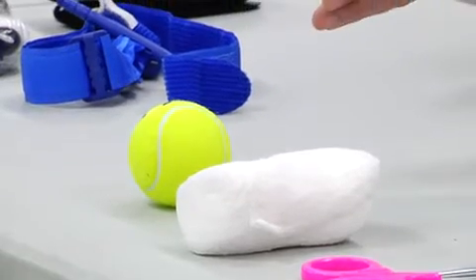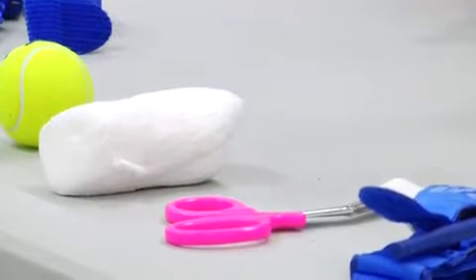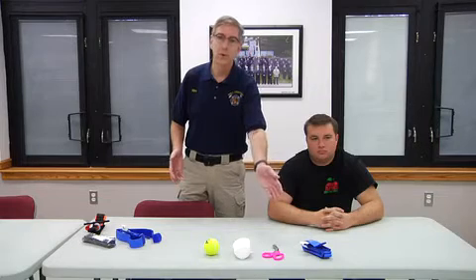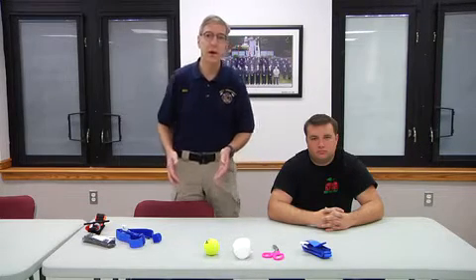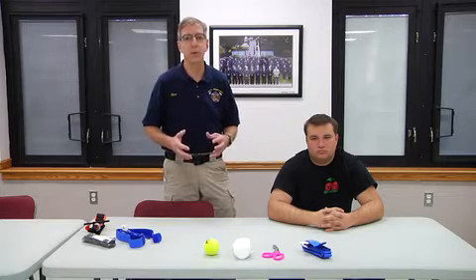We need a tennis ball, roller gauze, preferably 4-inch roller gauze, a pair of scissors to trim the gauze, and a training tourniquet. Today we're going to use the CAT tourniquet, which is a tourniquet that the military has specified as probably the most effective. I'll talk a little bit later about some potential alternatives that are coming down the line.